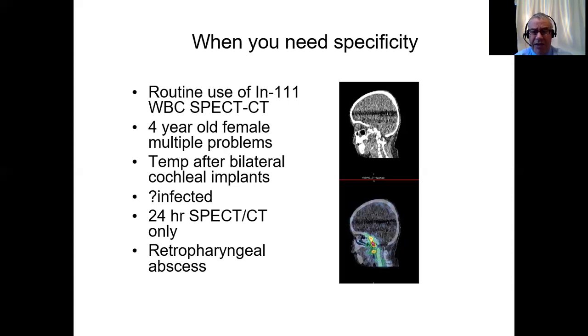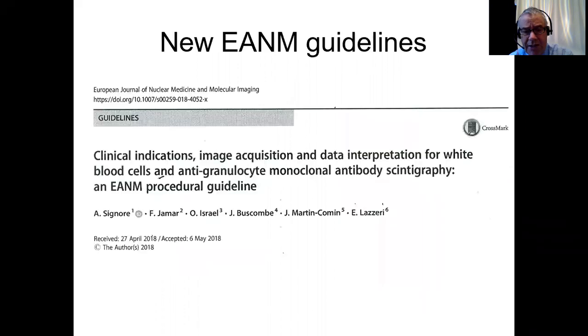And this is the relevant picture. And what it shows is that there's nothing in the head at all, but there are in fact 3 areas of focal uptake in the retropharyngeal space. And these are retropharyngeal abscesses, and they are post-operative. So what happened was because she was so difficult to anesthetize, unfortunately, the anesthetist had traumatized the back of her throat, and this had resulted in some abscesses, but they were very simply treated, and the patient was able to go home a couple of days later.